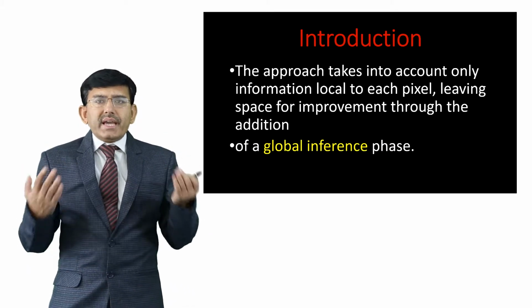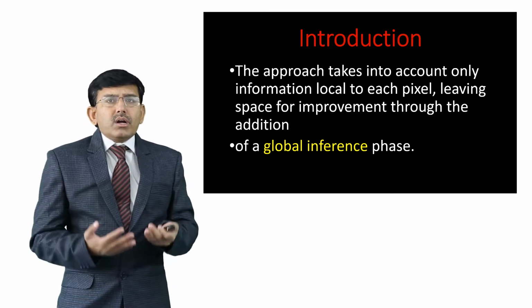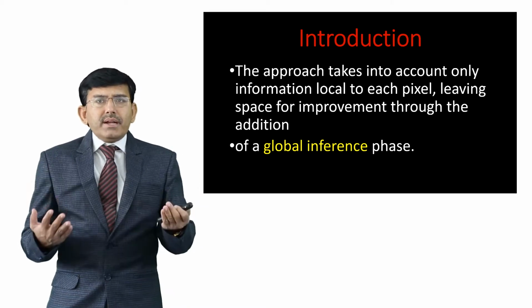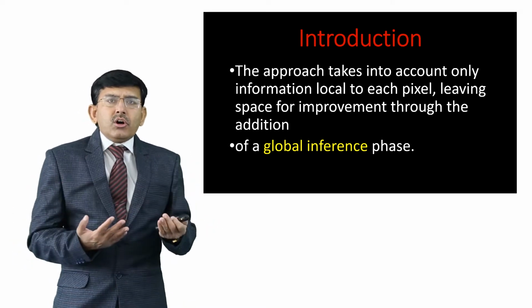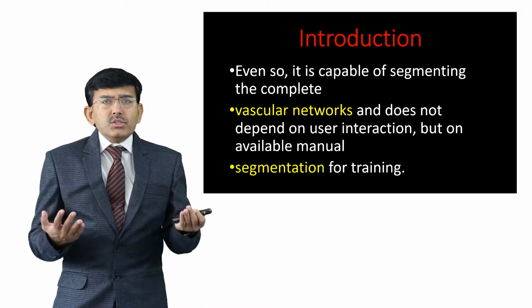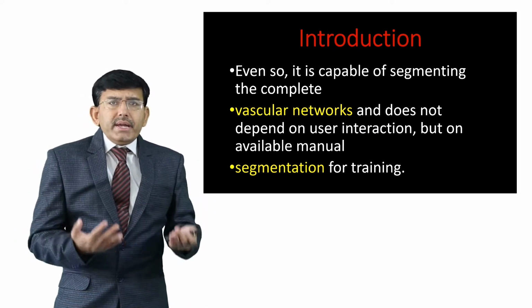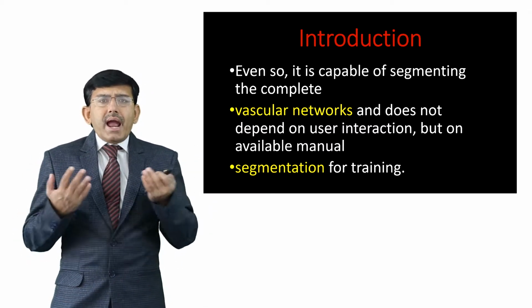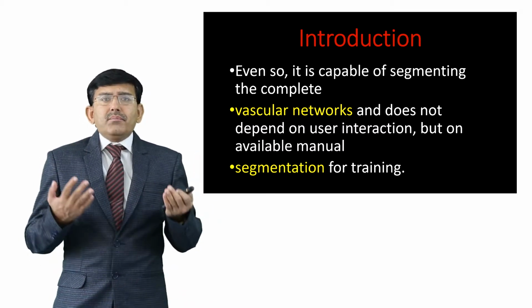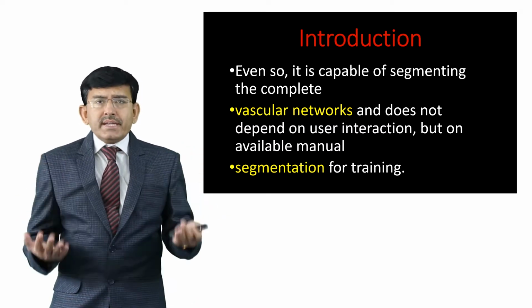The approach takes into account only information local to each pixel, leaving space for improvement through the addition of a global inference phase. Even so, it is capable of segmenting the complete vascular network and does not depend on user interaction but on available manual segmentation for training.